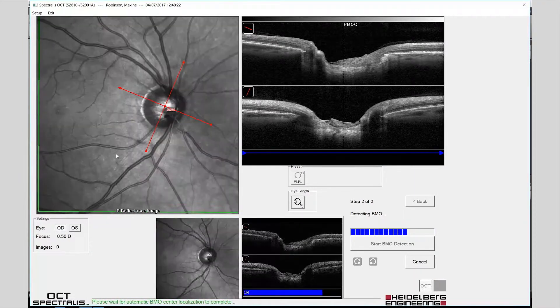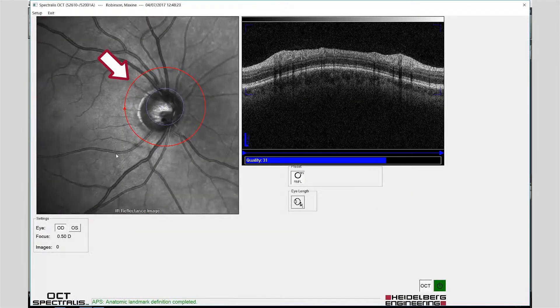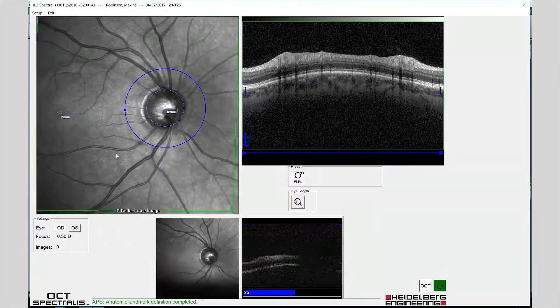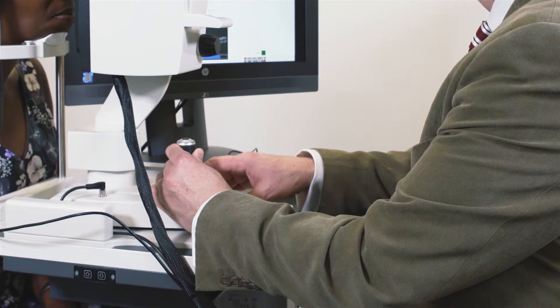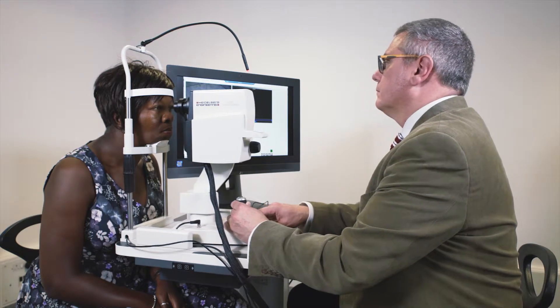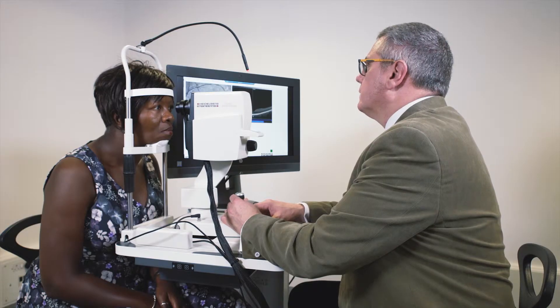The circular glaucoma RNFL scan will appear in the acquisition window. The circle colour will change from red to blue and the image can be acquired with a final press of the joystick button. You should maintain the camera position until the scan has been completed. Now move the camera head to align with the left eye and repeat the procedure for image capture.